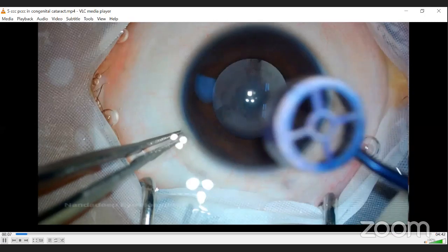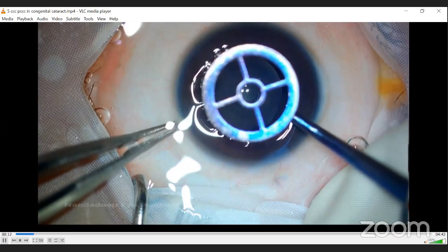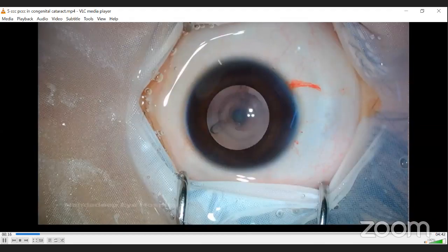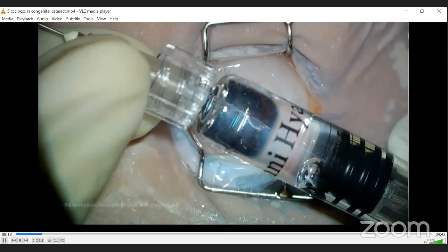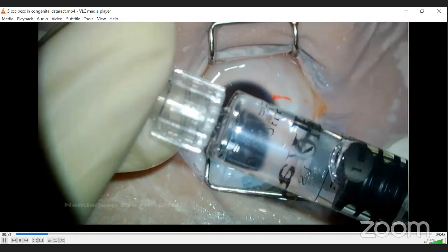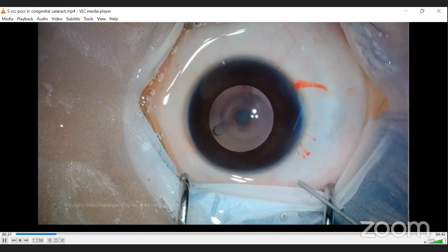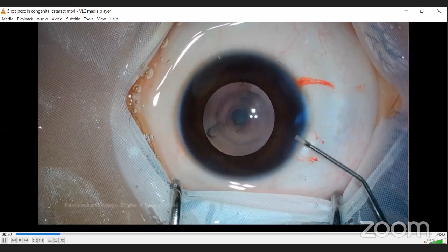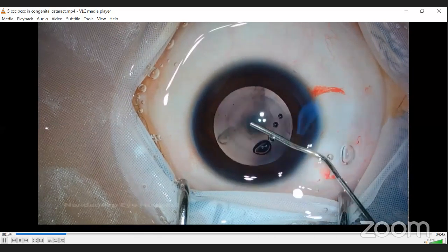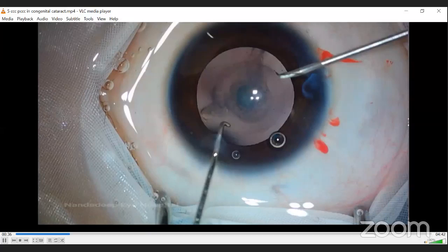Now, if you consider the first slides about the rules, just remember that in pediatric cataract, the sclera is elastic, the anterior capsule is elastic, the zonules are elastic and quite strong. The anterior lens surface is highly convex. So everything is against you. That's why there is a high chance of CCC extension in pediatric cataract.